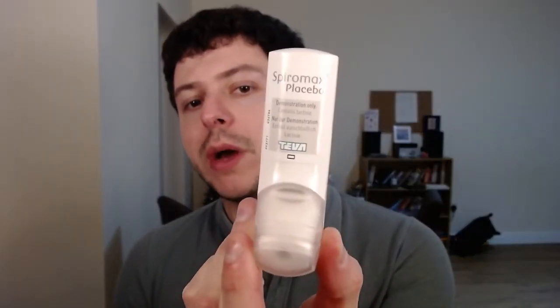Welcome back to another video on how to use inhalers. This time we will talk about another one called the Spiromax. The Spiromax is a different device — it's usually used in the inhaler called Duoresp Spiromax, which is a generic version of Symbicort.